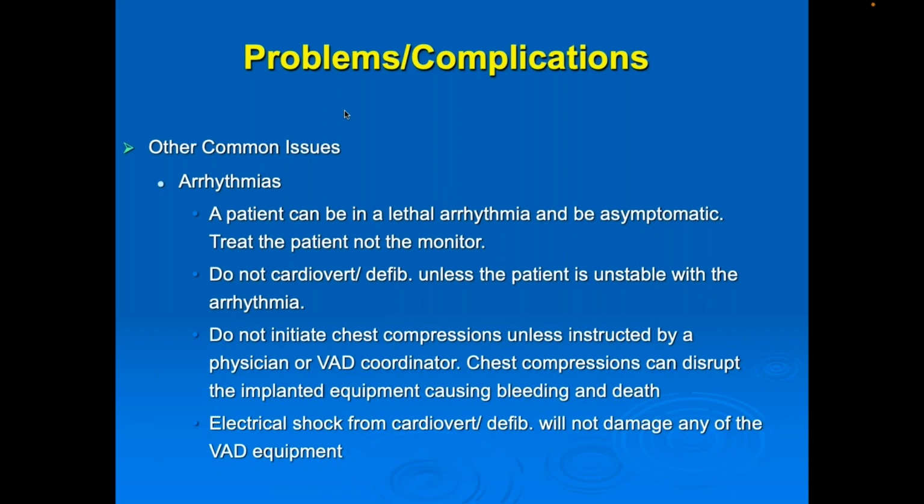So if you have a VAD patient within your community and you respond there for a cardiac arrest, please make sure that you're contacting medical control prior to your arrival or upon arrival on scene, before starting compressions.